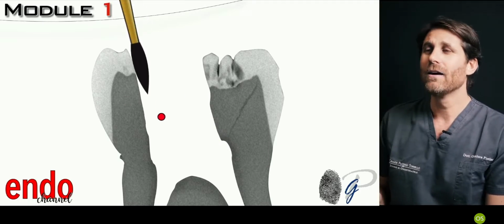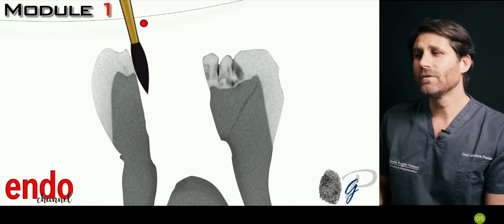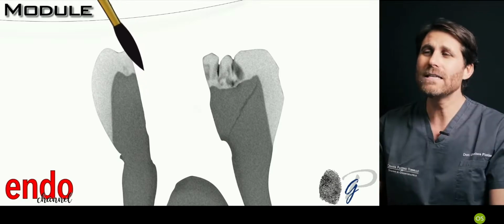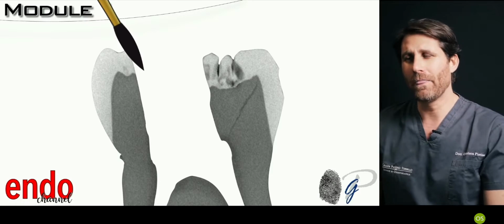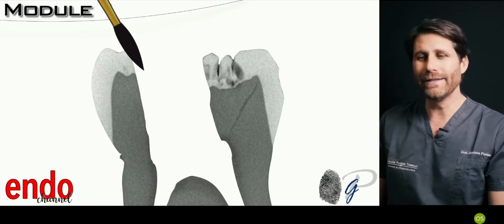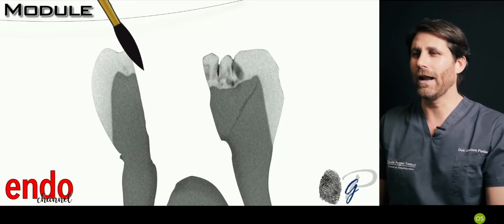So like a football burr, slimmer, so we can see both deeply inside the pulp chamber and in the coronal portion to create this enamel bevel, to remove this undermined enamel, to perform the technique that you have clearly seen during all this lesson in the endo channel.